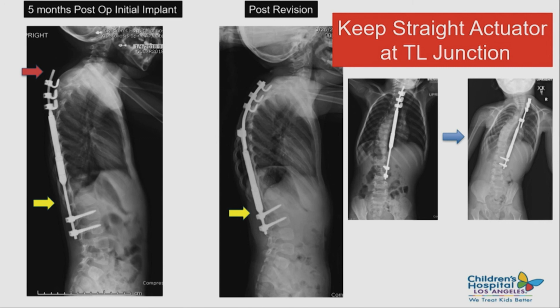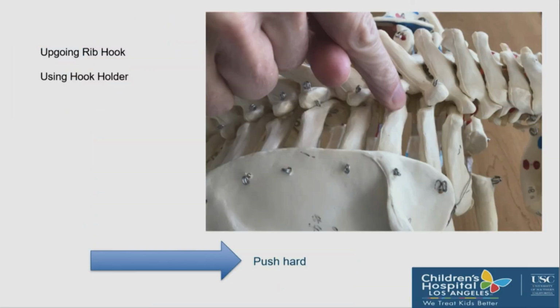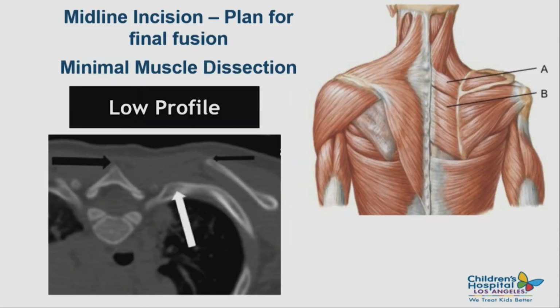I have one more comment about your approach to something we've spoken about a lot before, David. I really prefer to make that J incision in line with the rhomboids lifted up as a full thickness flap and then go right down to the ribs. And I understand what you're saying about placing the hook, but the thing is, by the time you place 3 hooks and then lay a rod in, you're going through a fair amount of muscle that you're going to need to approach again. So can you tell me your thoughts and experience about when you go back after you've basically done a whole longitudinal split of the rhomboid in order to get the rod in 3 hooks?